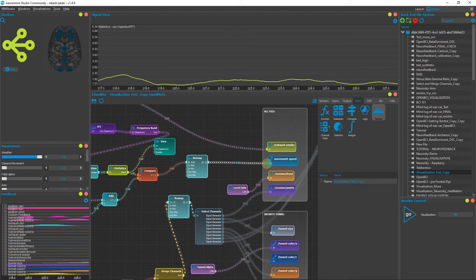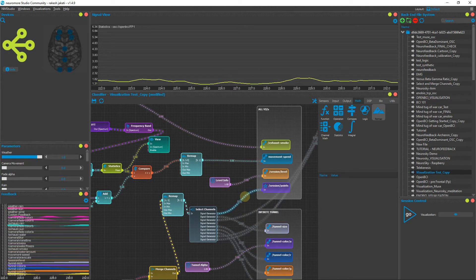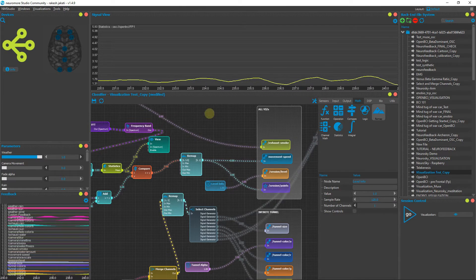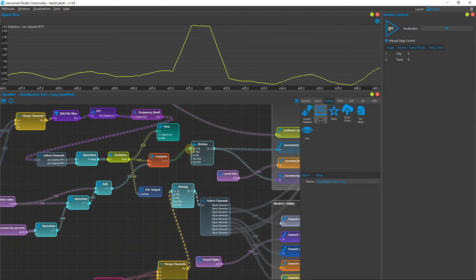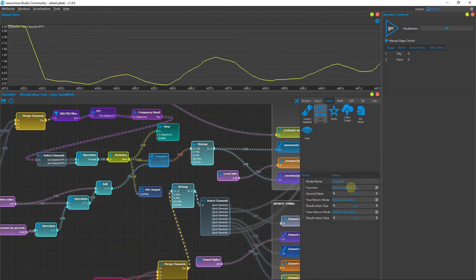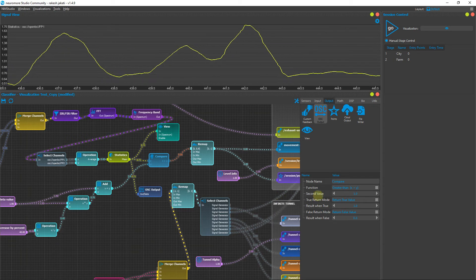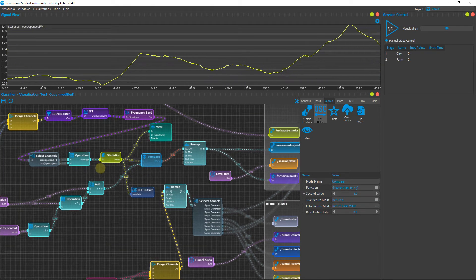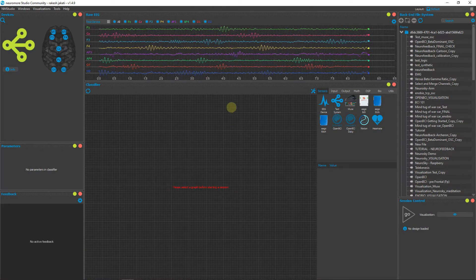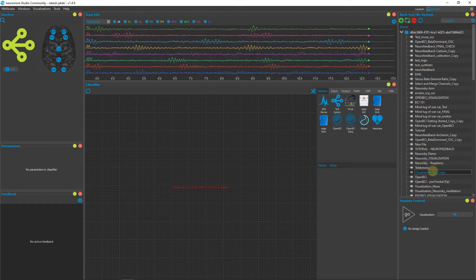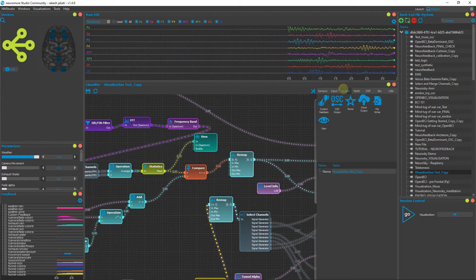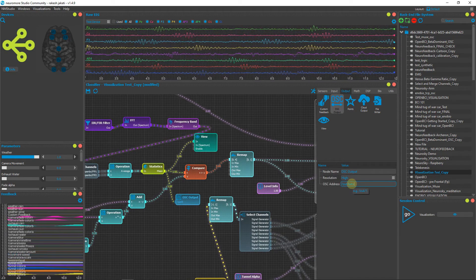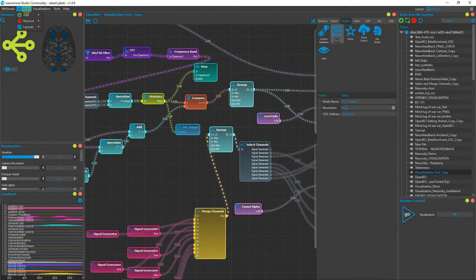Connect the Remap output to the Movement Speed node. Connect the session points — delete the old connection and connect the output so that whenever you get a feedback value, points are added. Connect the Compare output to the Remap node. In the Compare settings, set it so that whenever signal X is greater than Y, it returns X (true return mode: return X). Before playing the game, go to your pipeline, add an OSC Output, connect the Statistics output to the OSC output, give it the address 'out.data', and save. Add a Signal View to monitor.